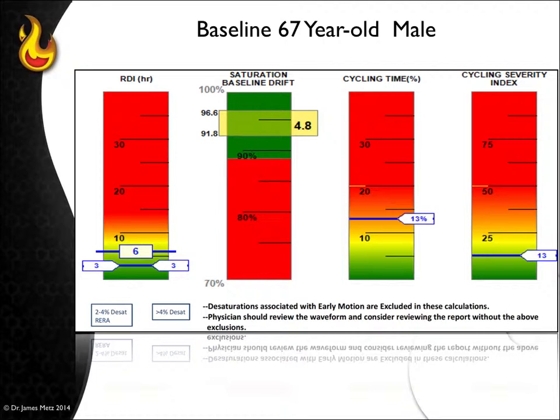It's very important for the patient to lay still at the beginning of the night and not go to sleep for 5 minutes and allow the oximeter to gain a baseline. If they just go right to sleep, sometimes they never gain a baseline over the night. So if they put it on, lay quiet, and stay awake for 5 minutes, you will get a better baseline drift approximation than if they just go right to sleep.